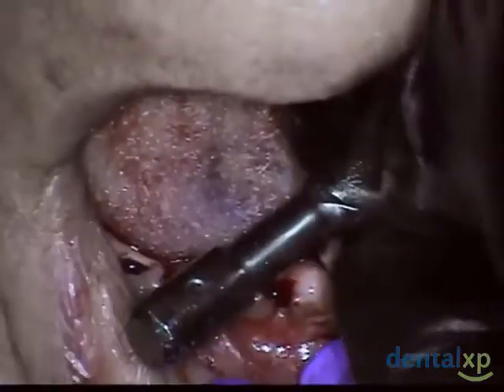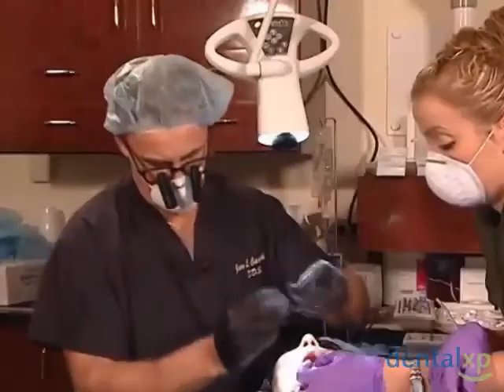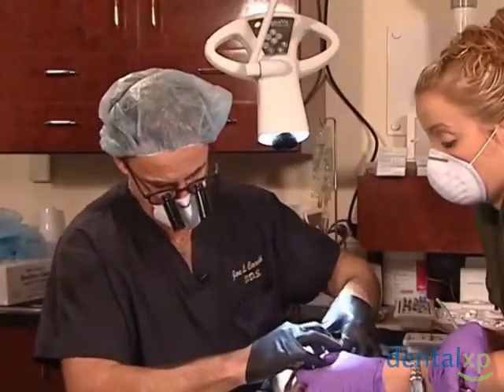And I can bring this up just a bit. Now, I could have left that there, probably been fine. I'm real anal about this kind of stuff. If it's a half millimeter, I'm going to take it a half millimeter further. We have a 15 millimeter implant here. I don't think that'd be a problem, but I want that abutment to be seated on the crestal bone, and it was about a half millimeter off the crestal bone, which would probably allow for tissue undergrowth, which would also make it more of a challenge for our patient to maintain this implant. We'll place this back on and take it all the way out.